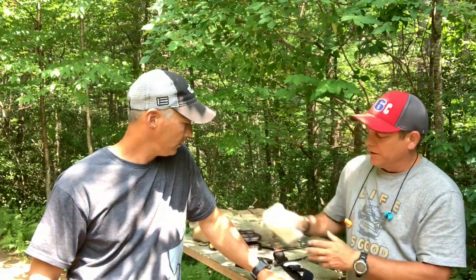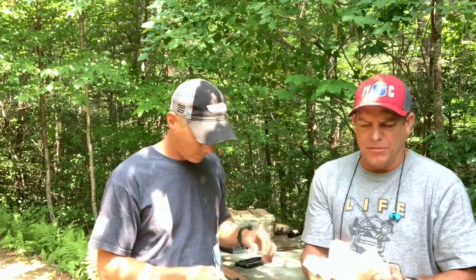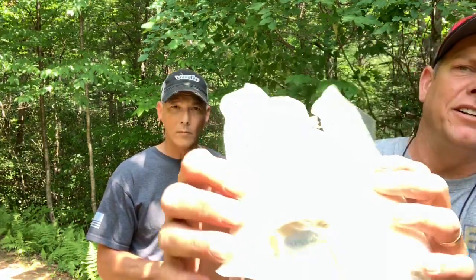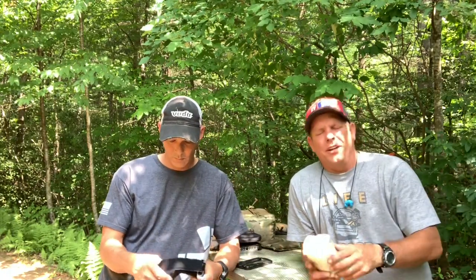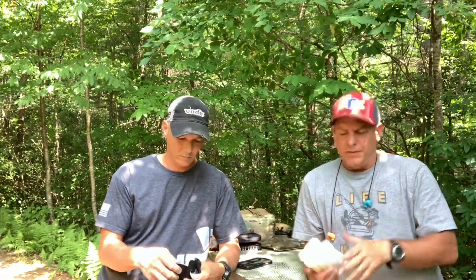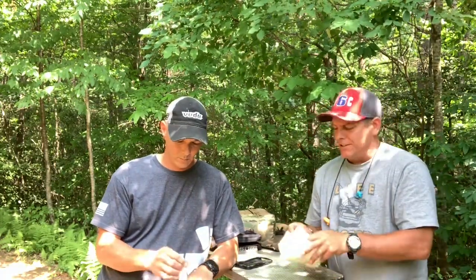I can kind of tell you a little bit about this if you want. Yeah, go ahead. So this is a little bit different. It's not a CAT tourniquet. I got gloves, I got a sterile bandage in here, and then I have, you guys can see, the lighting's really bad, a cohesive bandage that's 5 yards long. This is always in my gun bag, but a lot of times it's not a gunshot wound, and having a little bit more ideas and being able to use this as a backup to something. Let's tear this open because it's not sterile anymore.